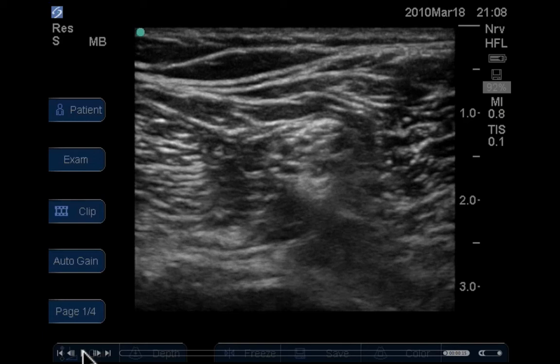You can have the patient supine with their knee and hip bent at 90 degrees and held, or with the patient's foot on the trolley and the probe right behind the knee. Or you could have the patient's ankle on your shoulder, and that will allow you to hold the probe in either your right hand or your left hand and come in medial or lateral to block those two nerves.